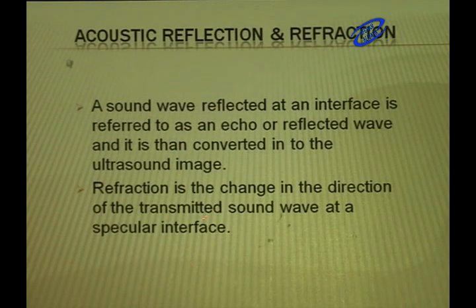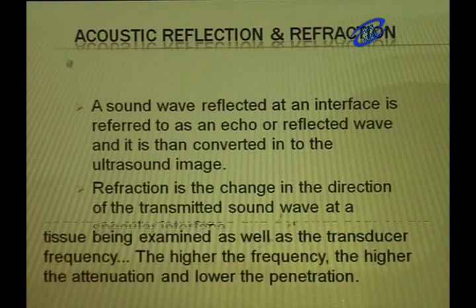Whereas refraction is the change in the direction of the transmitted sound wave at a specular interface. So in refraction, the sound waves are not coming back to the same medium, rather they continue their journey into the second medium with a change in their direction after striking an interface.